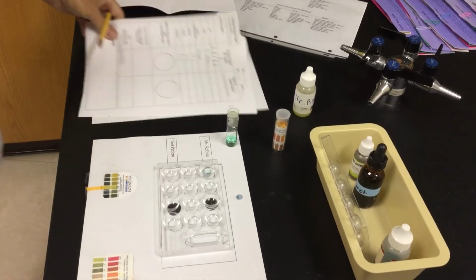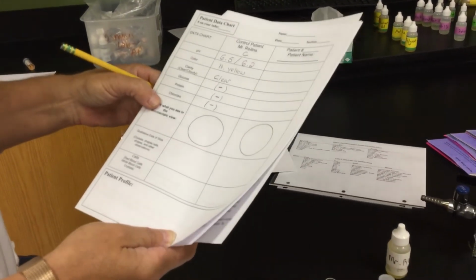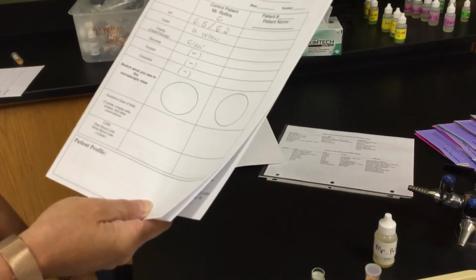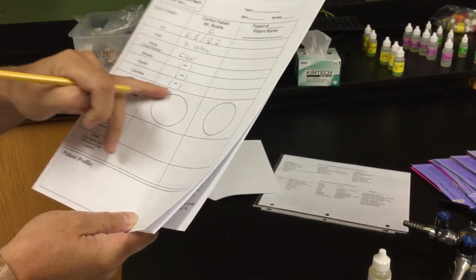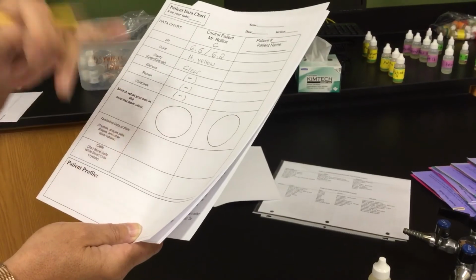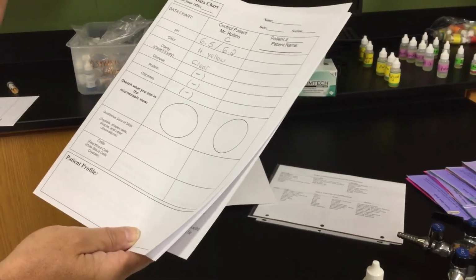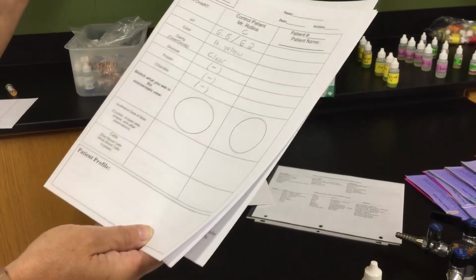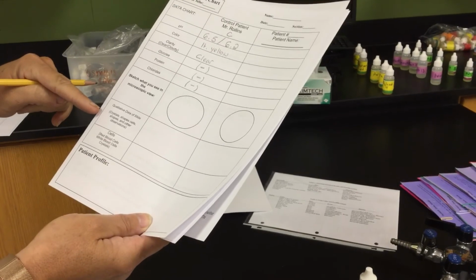So now what that leaves us is a little area that you are going to go through and look at a microscopic view. Your sheet actually says copy. So on Google Classroom, you'll see Mr. Rollins, normal slide. I have a slide there of a microscopic view. You're going to copy and paste it. It's underneath the microscope. You'll see the little pointer there. Copy and paste it and put it into this area. What that's showing you is it is normal. There might be a few things, a few cells here and there, but nothing that's causing any concern with this particular patient. Give a qualitative data of that particular slide.